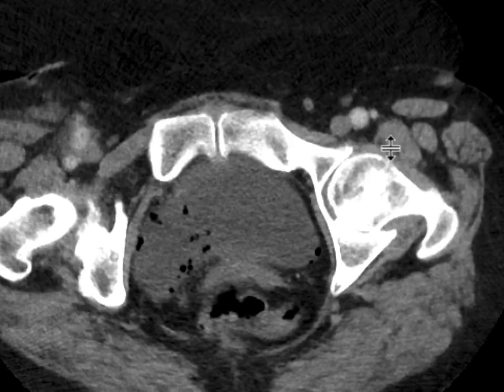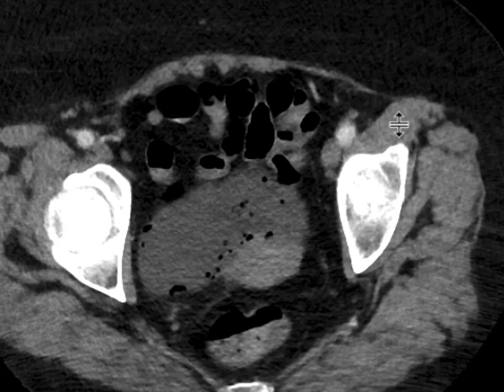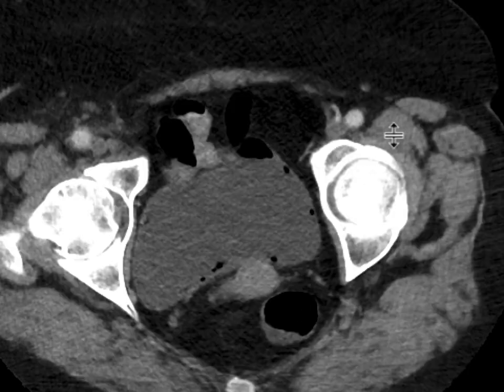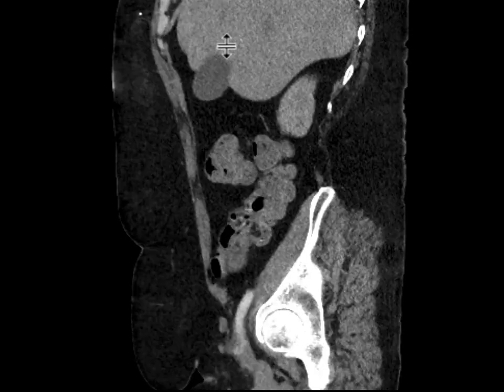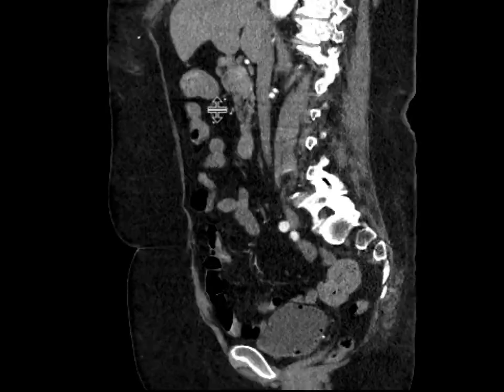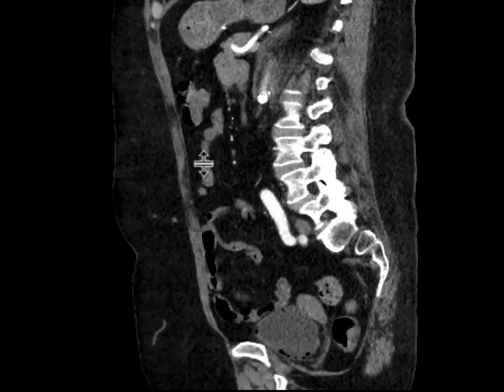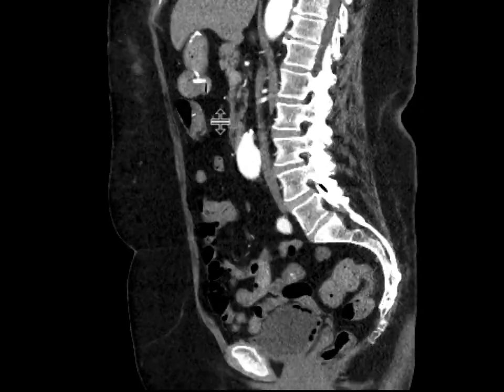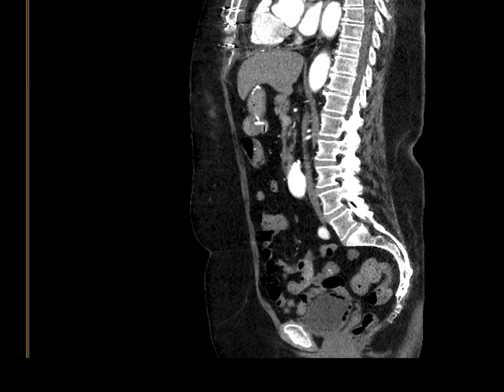Many of these foci are really within the non-dependent portion of the bladder, and so this is a great look for emphysematous cystitis. We can see this nicely on the sagittal CT images in this patient, where lots of these foci of gas are really up against the non-dependent portion within the bladder wall itself.